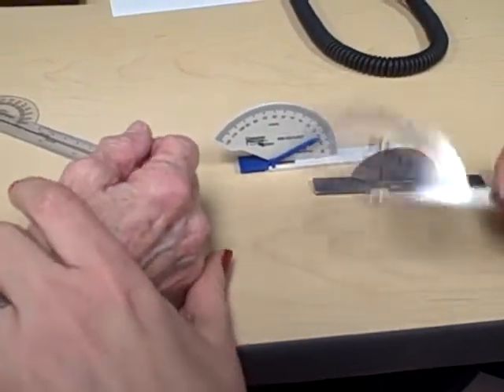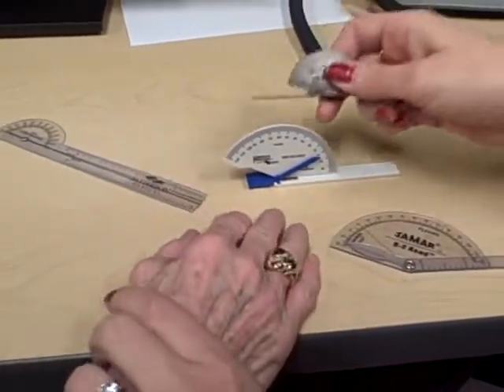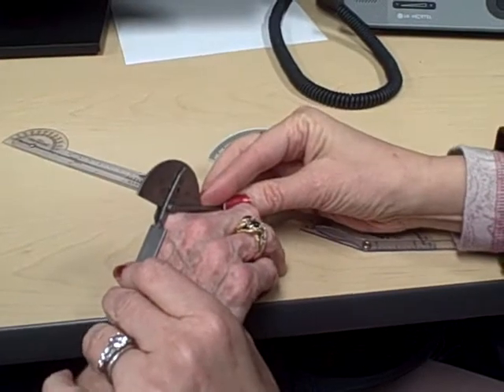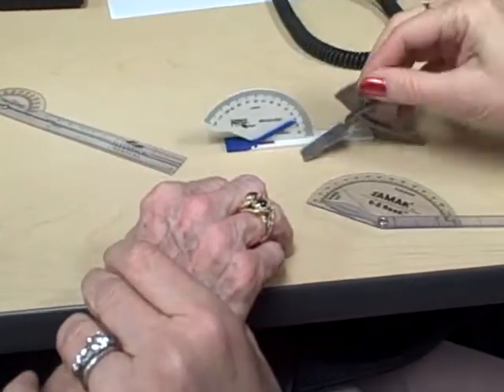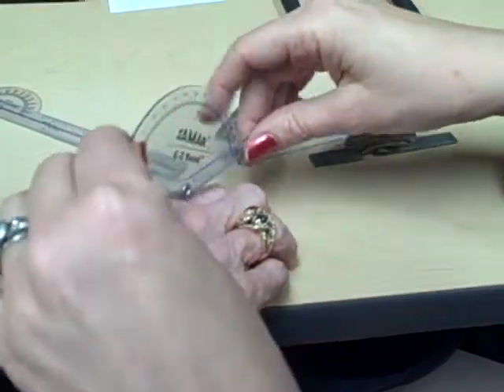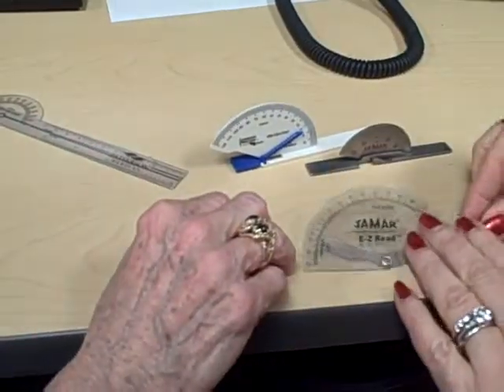This is going to make a difference because on these goniometers you can just lay them very easily on the back of the hand, on the dorsum of the hand. But on this one it's a little bit more difficult because you have to actually be holding it up.